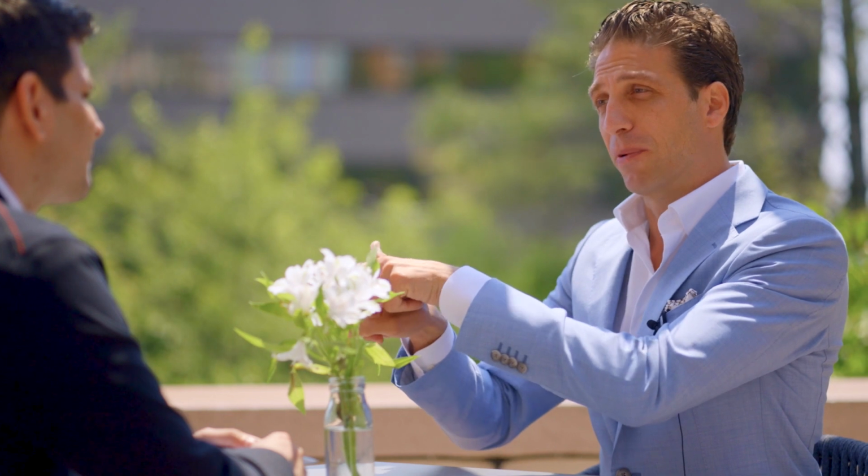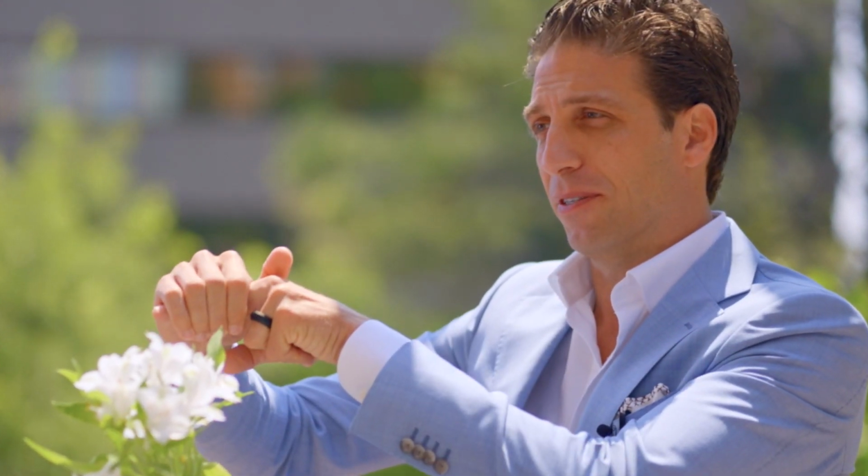So everyone is curious, does this affect ejaculatory function, erectile function, their ability to urinate? The way the implant's designed actually wraps around the penis 270 degrees. So when I talk to guys about penile anatomy, I say, think of 3 cylinders. You have 2 on top called the corpora cavernosa that fill with blood during an erection. 1 on the bottom called the corpus spongiosum, which carries the urethra, which allows us to ejaculate and urinate. The implant actually just wraps around those top 2 cylinders, right? So it doesn't touch the bottom cylinder that carries your ejaculate and your urine. So it has no effect whatsoever on your ability to urinate or to ejaculate.